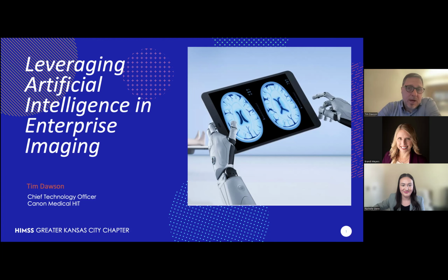And so, is it possible that some radiologists will skip through and let the AI do it? Well, maybe. I think that really depends on how you handle the workflow. If you set the AI results to be at the end of the workflow, you can use it to verify what the radiologist caught. Or if you set it at the beginning, they do have to decide whether they agree with it or not.